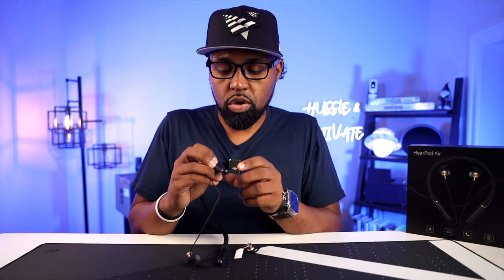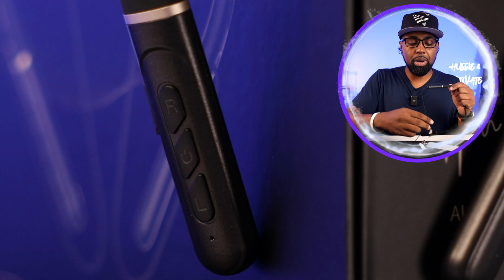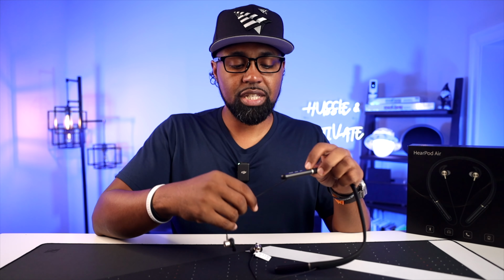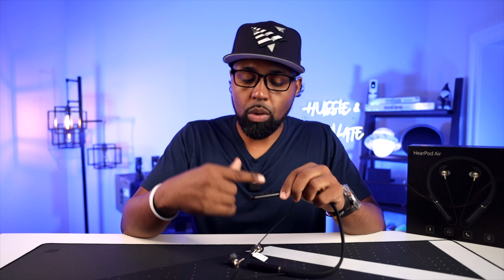You do have your left and right button, so you can adjust the sound of your left or right earbud individually, or you could do it at the same time. When you hold the left or right button down for about 2 seconds, it will activate the single volume adjustment to be able to adjust each sound individually. But if you don't want that on, you can just leave it alone and then just hit the left or right button, and it'll adjust both of them up or down.